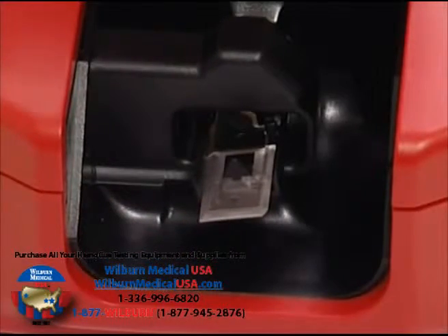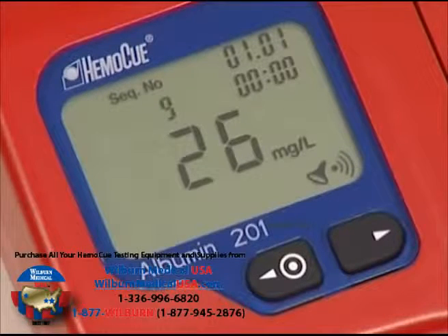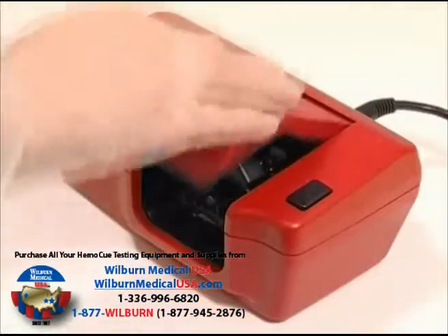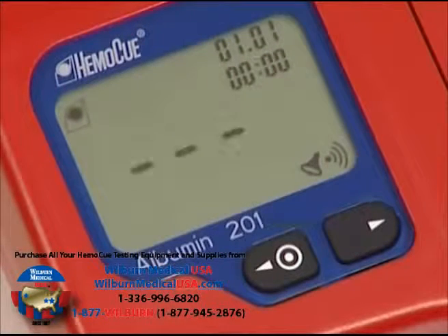Close the lid. During measurement, an hourglass symbol and three fixed dashes are shown in the display. The results in milligrams per liter will be displayed within 90 seconds. Record the result. The result will remain on the display until the lid is open. Open the lid and discard the cuvette, and then close the lid. When the display shows the HemoCue symbol and three flashing dashes, a new measurement can be performed.